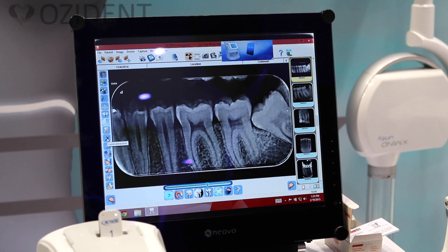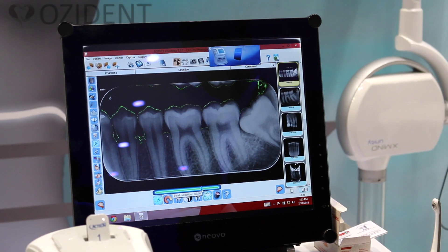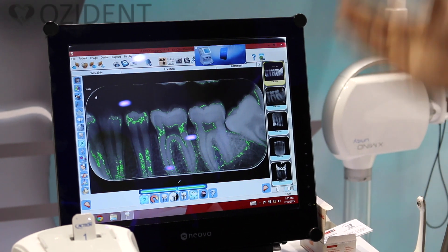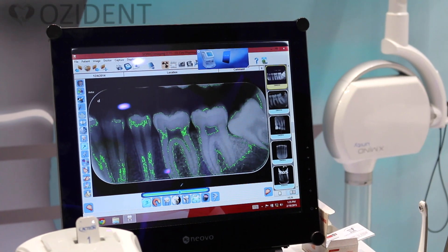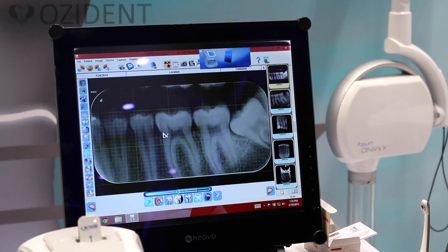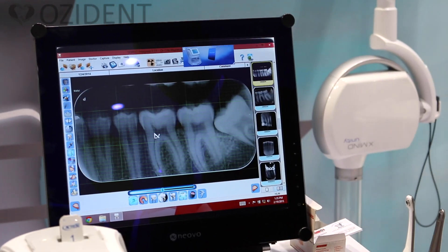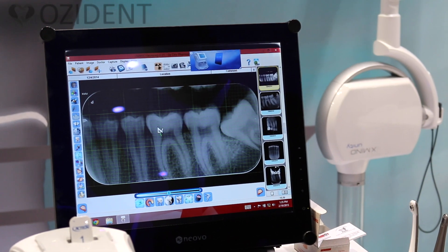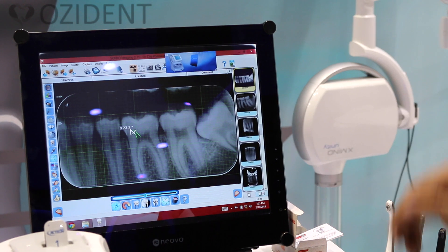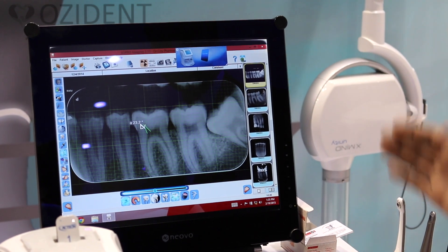After that, this is level extraction — by choosing this option, different parts of the image are emphasized so you get a better view of the tooth. Then you have the angle measurement tool. For example, if you want to measure an angle, you click to start, set the end corner, and it gives you the exact angle — in this case 23.2 degrees.